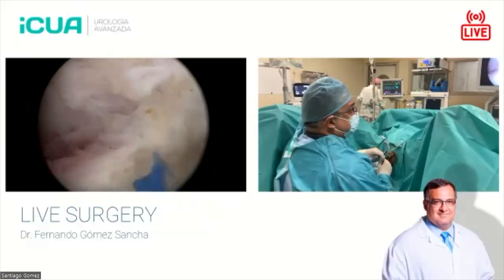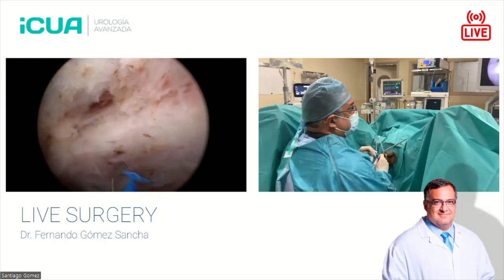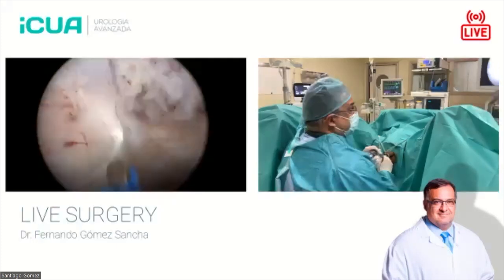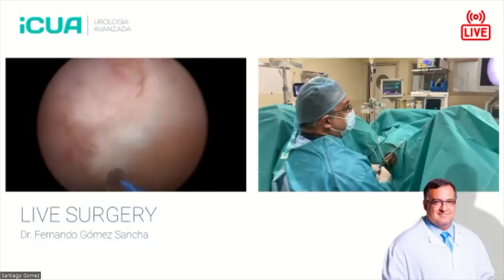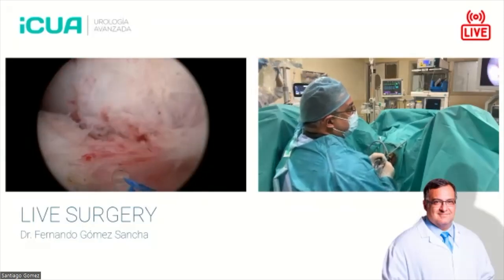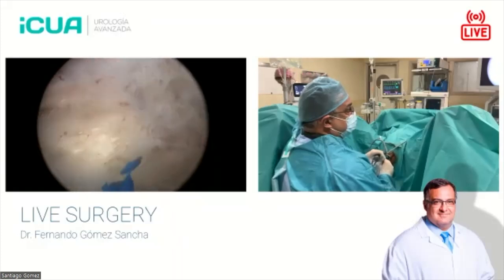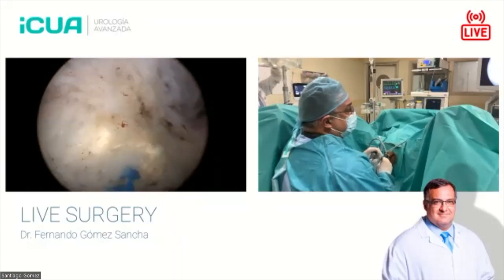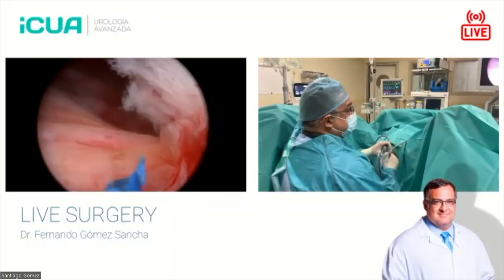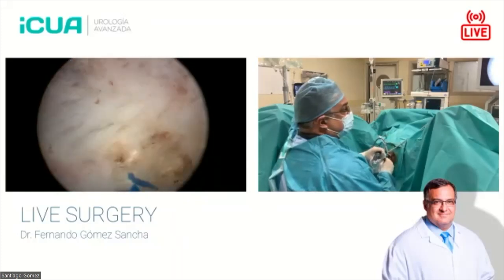A little bit poetic. And Fernando, if the adenoma is too big to go inside the bladder, what's your recommendation? Do you cut at six? Now, no, because it's rotated, but it's very easy to split it in two. You go to the prostatic urethra and you can very fast cut it in two. And of course, if you can make sure that there is no attachment here, even when the adenoma is inside the fossa, you could try to do intracapsular morcellation.